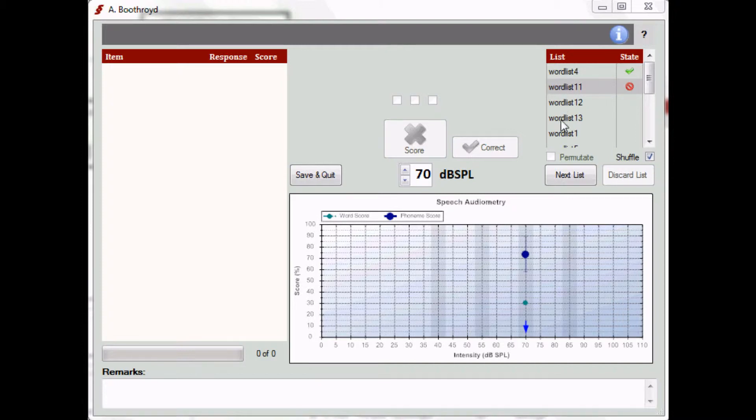By default, ACE randomizes the play order of the different word lists. You can uncheck the shuffle box to disable this randomization and to impose the predefined play order.